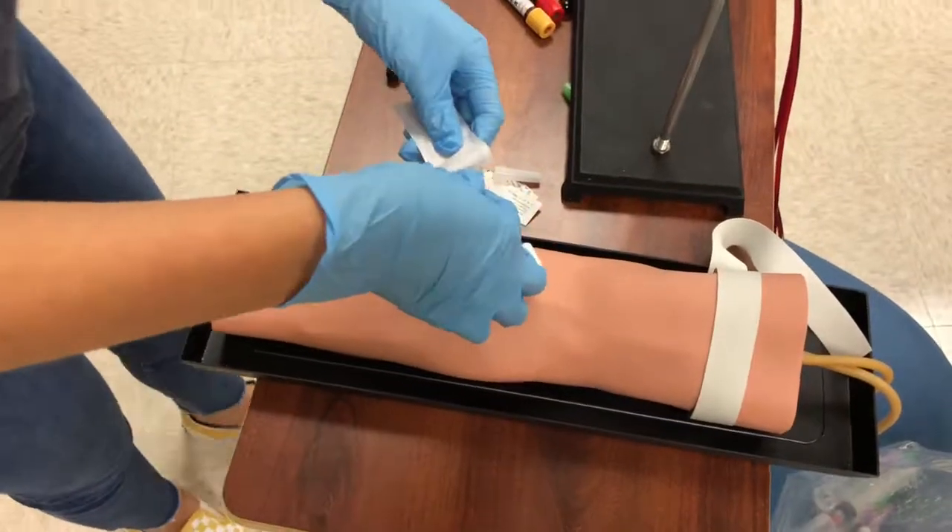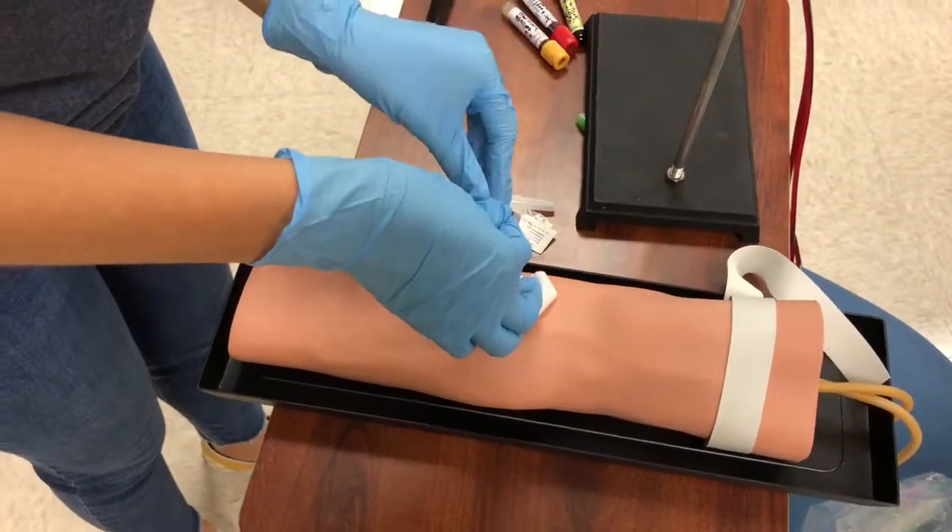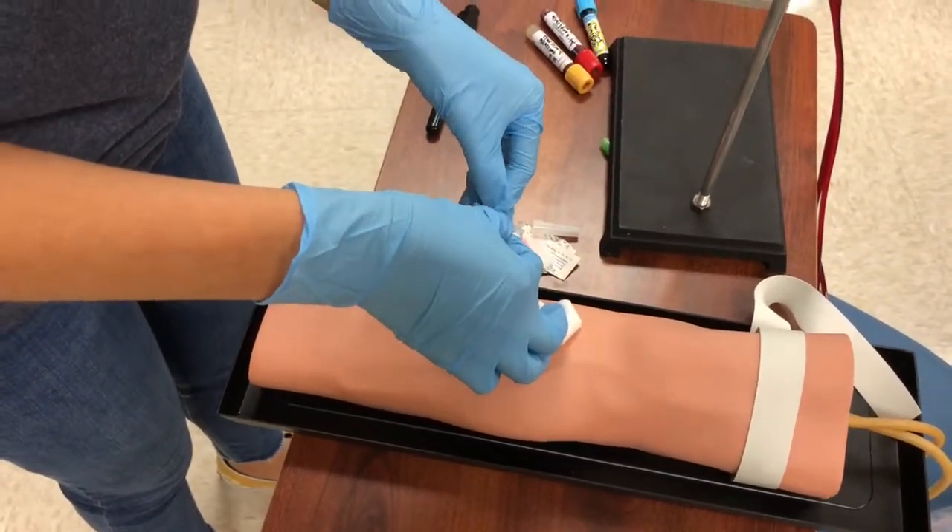I check the site where I performed the venipuncture. The site is not bleeding heavily. I get the bandage and put it on the patient.